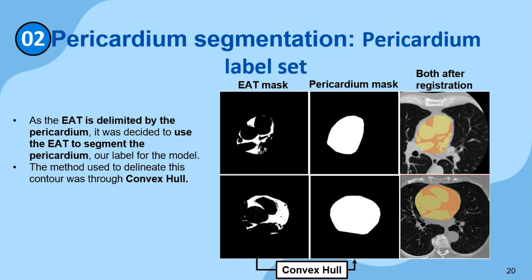The convex hull is the smallest convex shape that contains all the pixels, which can be found with a set of iterations in which it is constantly evaluated whether or not a point is within a defined facet. To initialize the algorithm, 2 points are selected in two-dimensional cases, if possible points with either a maximum or a minimum coordinate.